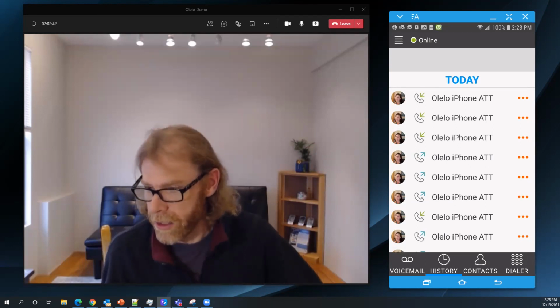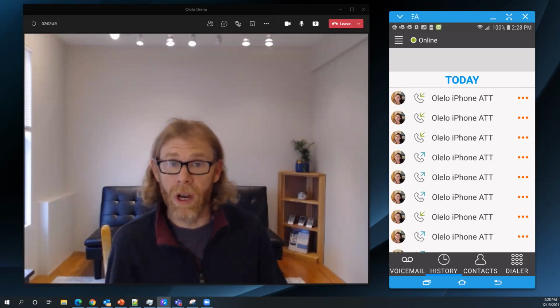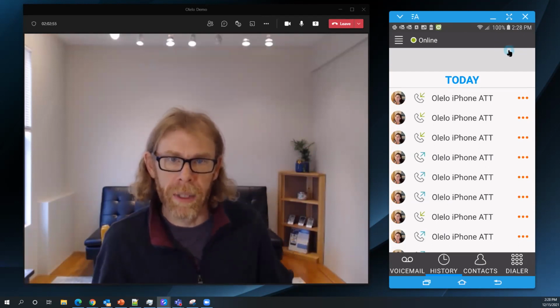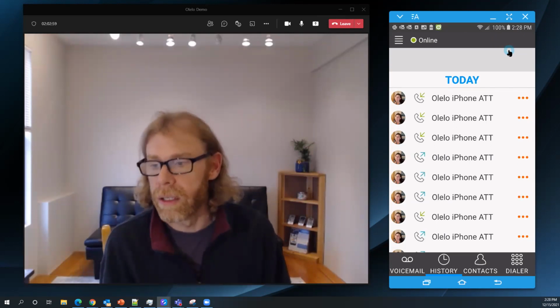How do we answer a forwarded call? I'm trying hard to get through these questions in the limited time we have left. You answer a forwarded call just like any other call. You probably saw me tap up here to answer when I get that incoming call notification. That's what answering a forwarded call will look like when you get it in Olelo.